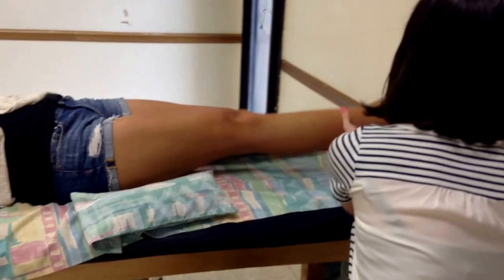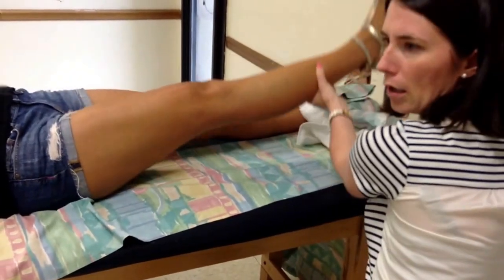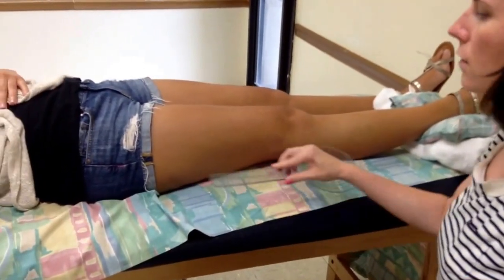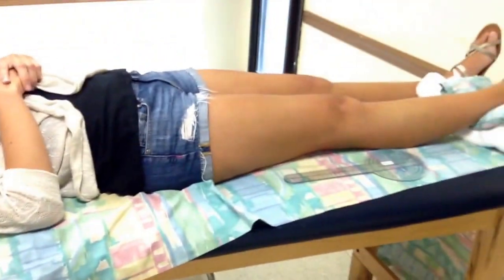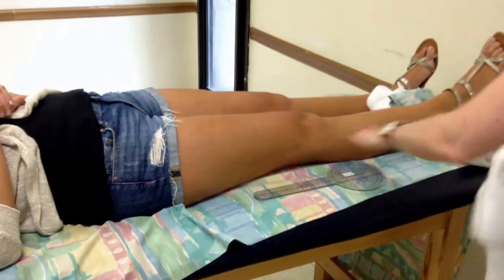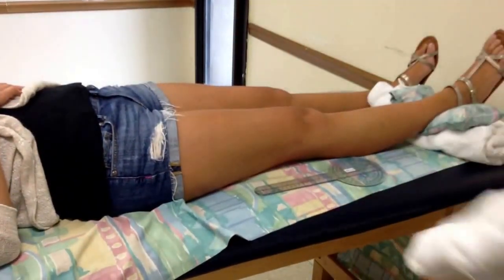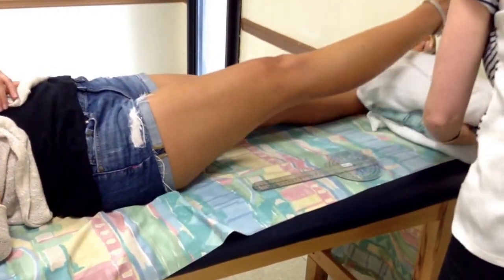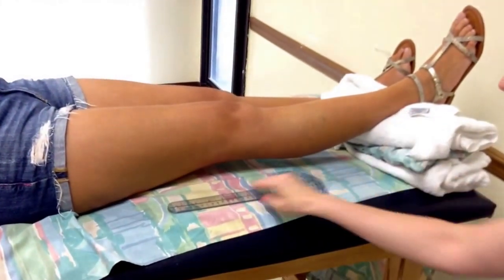So we're going to prop up her ankle and foot on a towel roll. It needs to be high enough so that the bed is not limiting her range of motion. Suzanne, can you grab another towel? Okay, we've got enough towel rolls now underneath her foot and ankle.